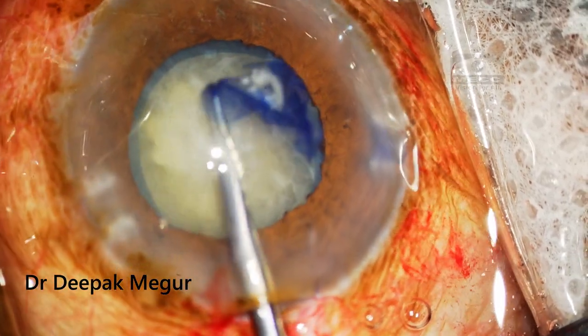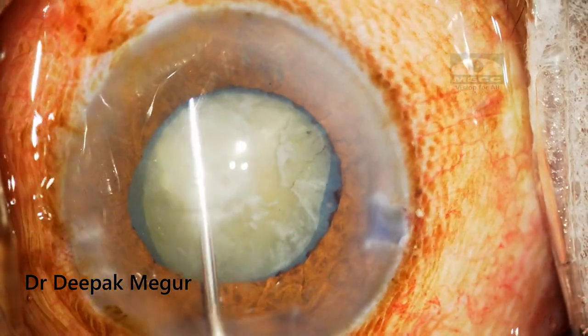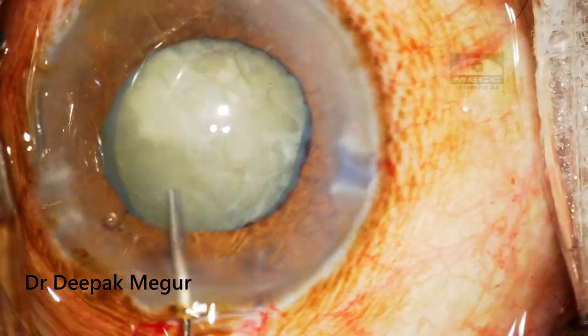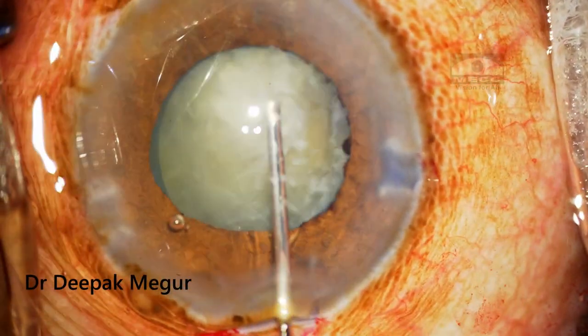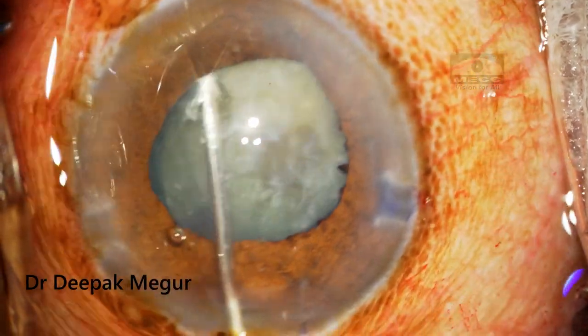Once the rhexis is done, the next step is to perform phacoemulsification of the nucleus. To begin with, I perform gentle hydrodissection and try to rotate the nucleus to ensure that there are no cortico-capsular adhesions.